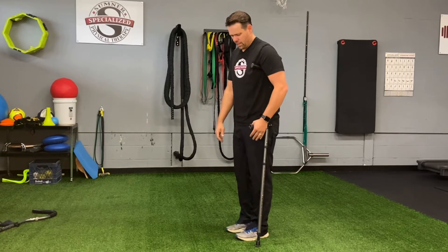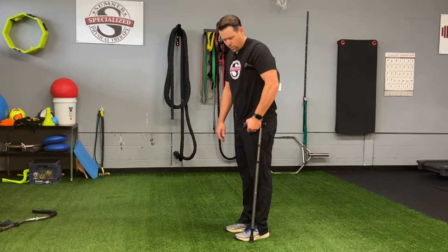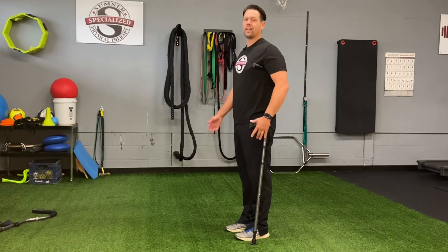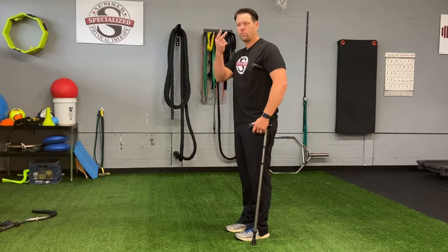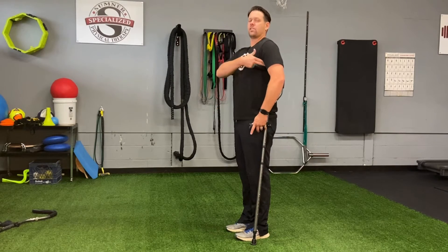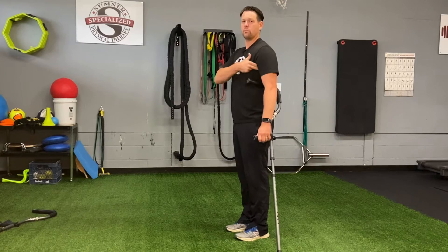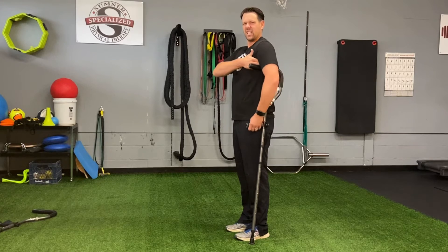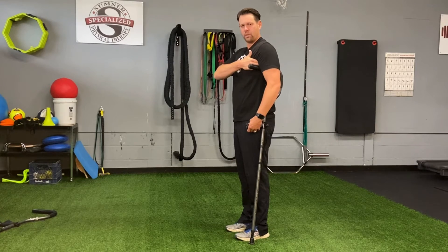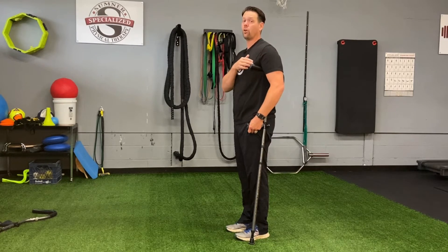First thing that we want to do is we want to stand really tall and we want to go to where our toe breaks in the shoe — we want to go out two or three inches, and that's our starting position for measuring our crutch. We take two fingers, about two inches, and standing nice and tall, we want two inches between the top of the crutch and the top of the armpit. It shouldn't be jammed up in here and it also shouldn't be so low that it's down below. That way the crutch isn't going to fall behind us, but also isn't going to jam up into our armpit.